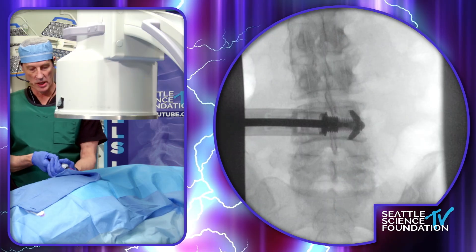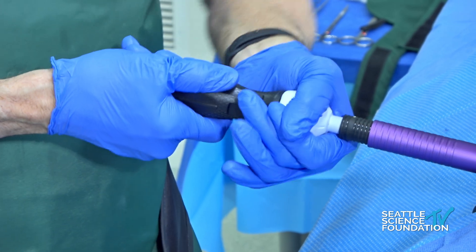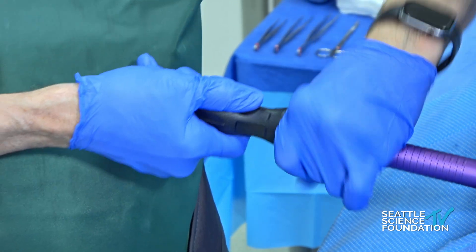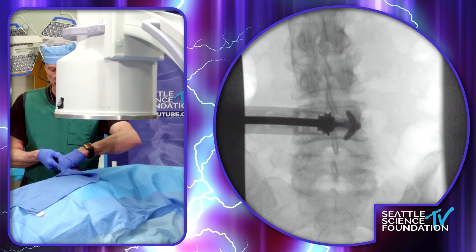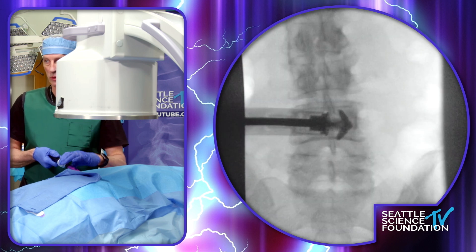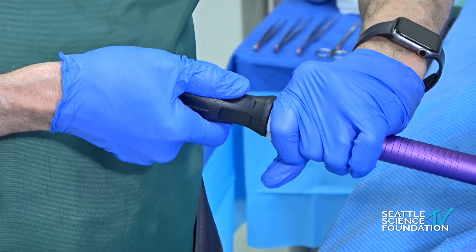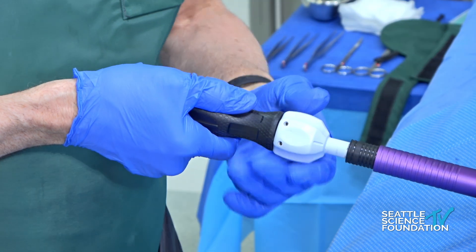We can see the wings have been deployed, and then we're going to pull the two together. This knob typically takes quite a few turns to pull the ends together. You want to make sure and keep the wings superior or inferior. Before the final tightening, we're going to look lateral. We want to see this come together, and you can see it's coming together very nicely. This is a round implant, but with the wing reference line, it's flat on the top and bottom. It's about three finger tight now — the same principle as dilating the VertiFlex spacer — three finger tight, and it's not over tight.